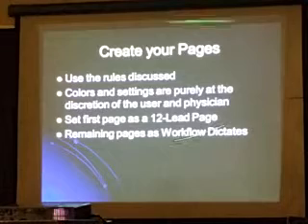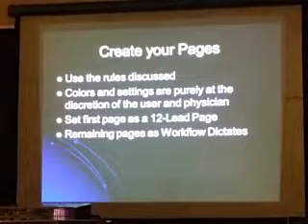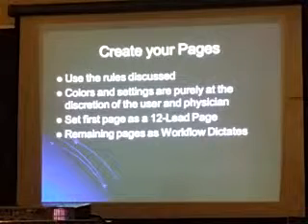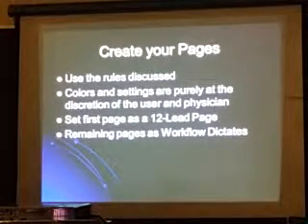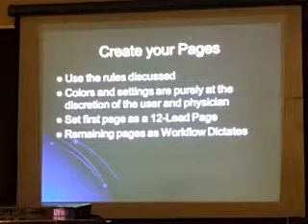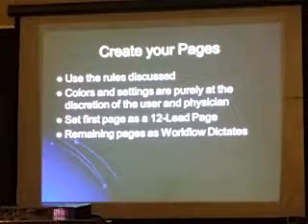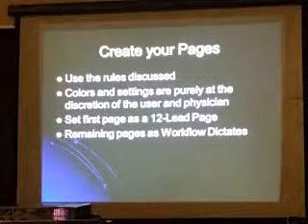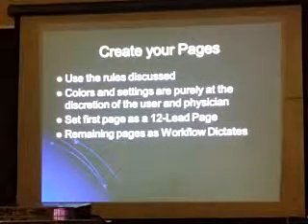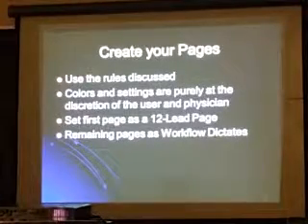So you get to create your own pages. In our system, we have 8 pages, and all you have to do is bounce down. The top page is usually your 12 lead, and then you have various pages underneath based on whatever catheters you have in the body and what you're doing. I usually try and have people set them up based on the workflow. So I'll have a 3 catheter page, and then underneath it I'll have the ablation added to it. Whenever you need your ablation, you just pop down one page and it's ready to go. Do the same thing with a 4 catheter: high right atrium, HIS, RV, CS, and then when he throws the ablation catheter in, it just flips down a page and everybody's ready to rock without any problems.